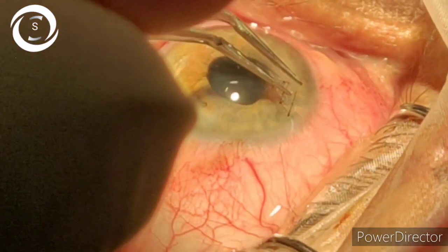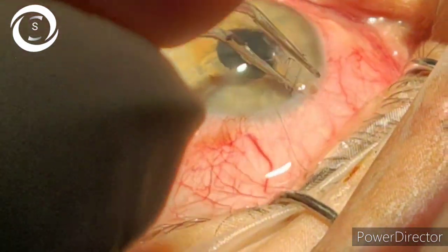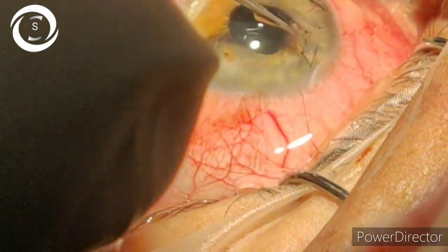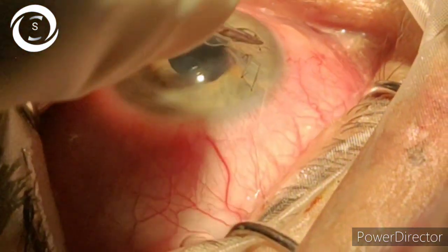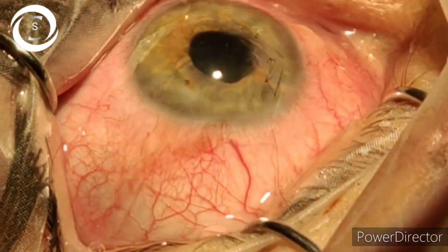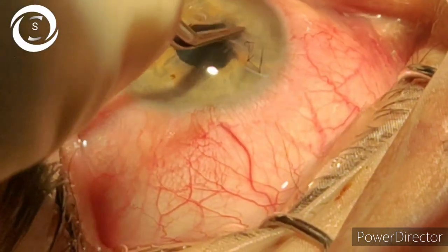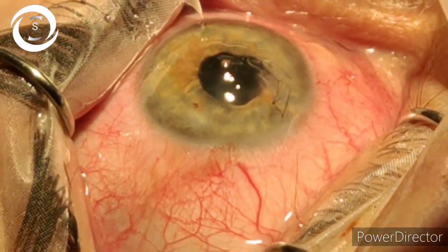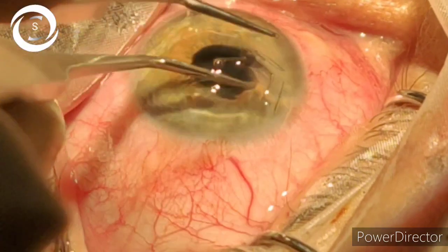We have completed two horizontal and two vertical sutures and I am now burying the sutures. I assessed that the anterior chamber has been well formed, but I thought I should further stabilize the corneal wound.